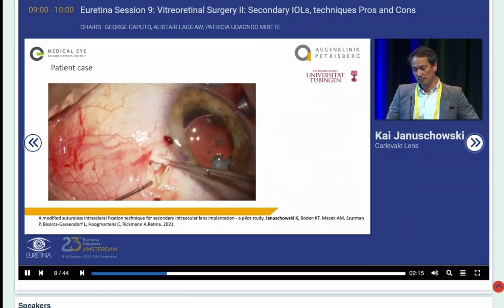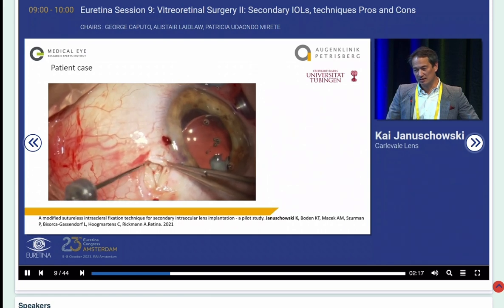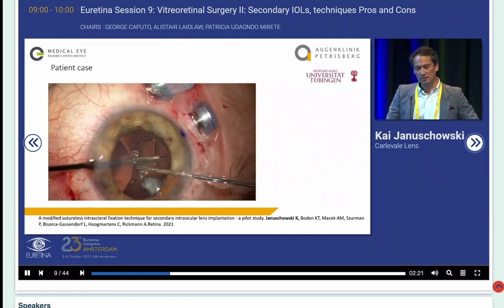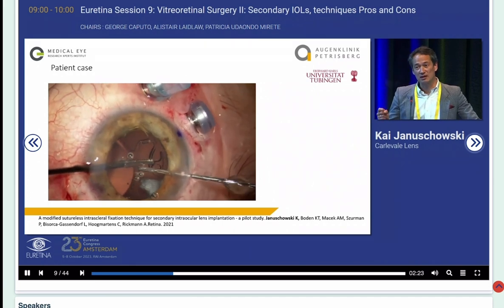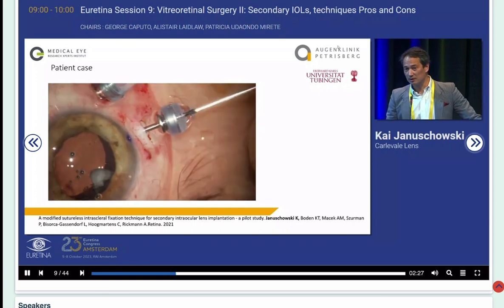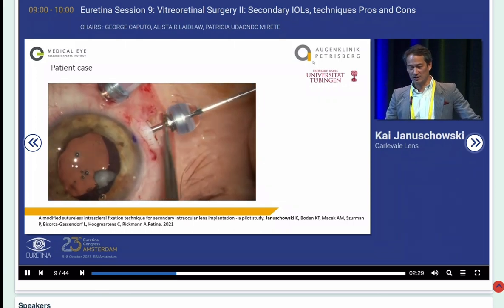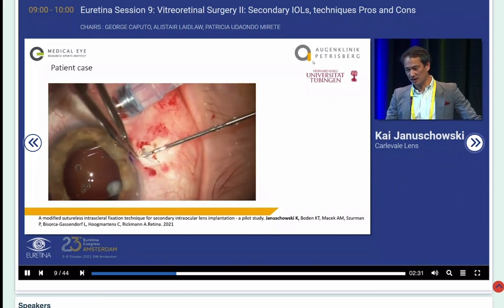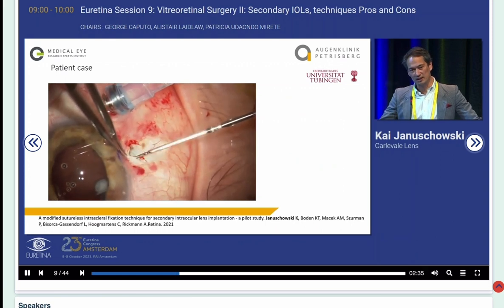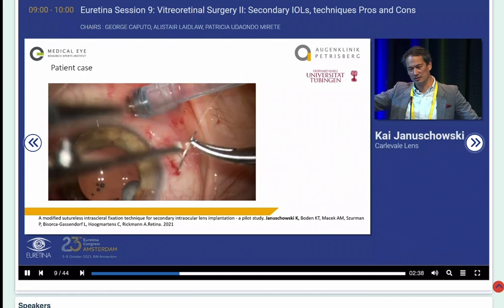Now it's very important when you externalize the anchor, and we'll spend time on that just a little bit. I think this is very critical. Externalizing the anchor is really the thing that will get you into trouble and will have you frustrated. So really, externalizing the anchor, and you see me there, I'm rather pushing in the sclera from the outside than actively pulling it out.